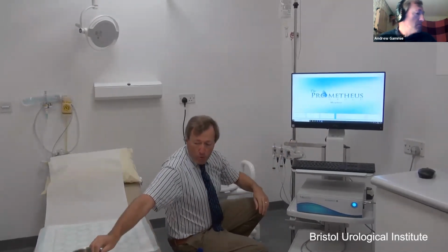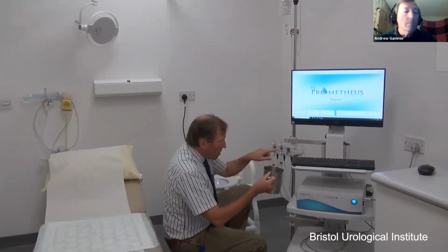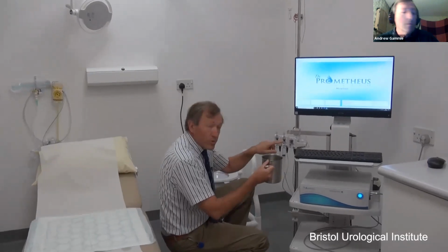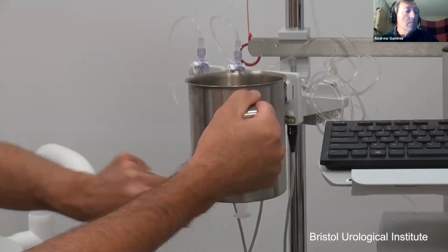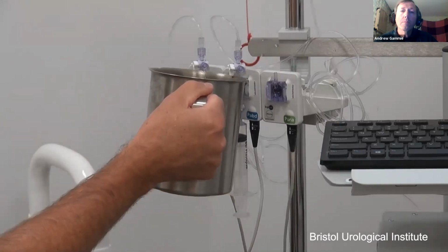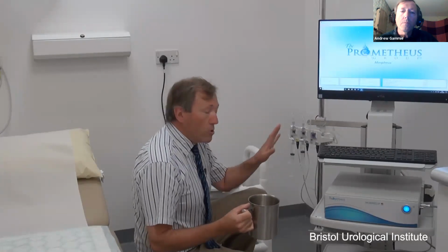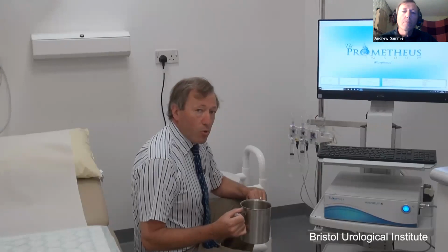Now at this point, I'll also give the system another flush to the side, just in case there are any bubbles that have appeared in the dome. I can't see any, but just in case, I'm going to flush to the side on each one before I close off the syringe. And again here, flush to the side and close off the syringe. Now I know that my tubes and my domes are completely filled with water and there's no air bubbles at all inside. Great, thank you.